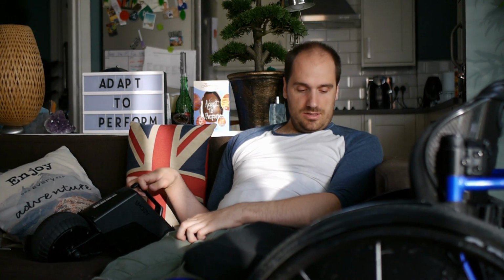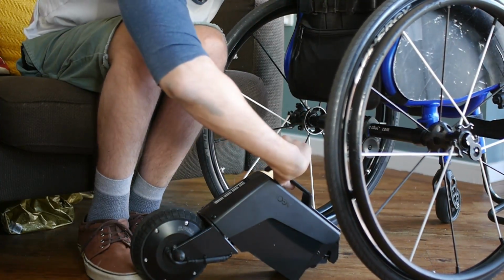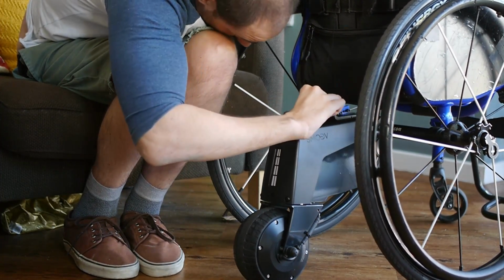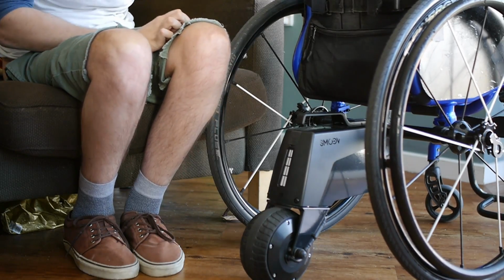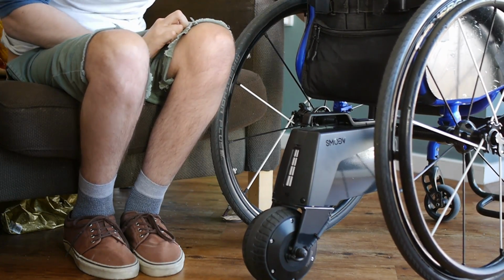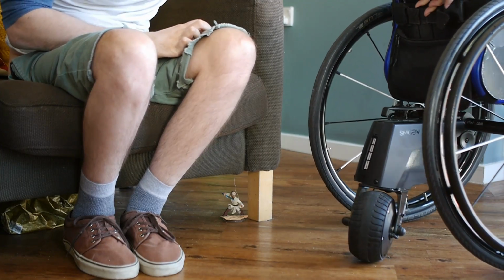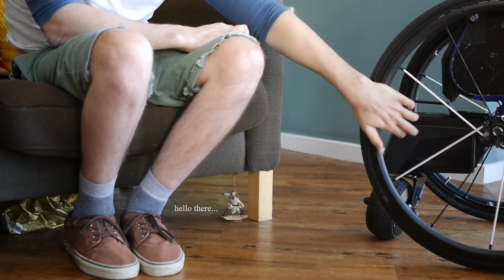Last thing is attaching it on and off the wheelchair. I couldn't do it while I was in the wheelchair, which was a little bit annoying. But again, that might be something that takes practice. I'm sure I'll find out a way when I'm trying to use it in Bali. So those are the things that I sort of noticed about it. But I'm really looking forward to getting this started and using this more and more.